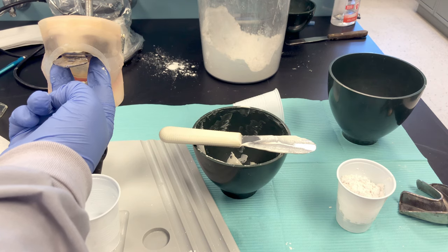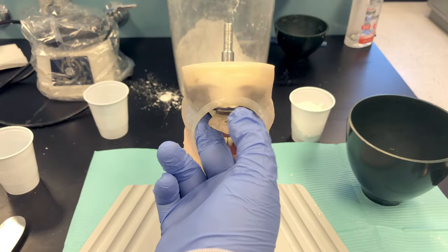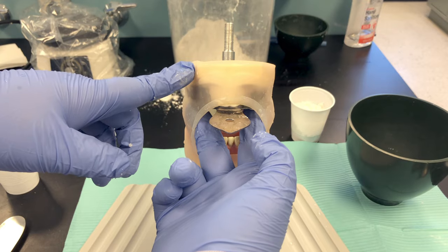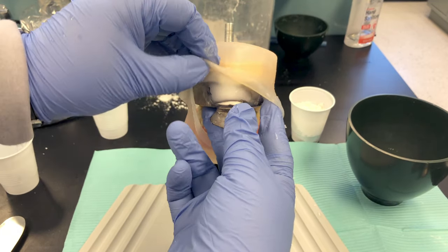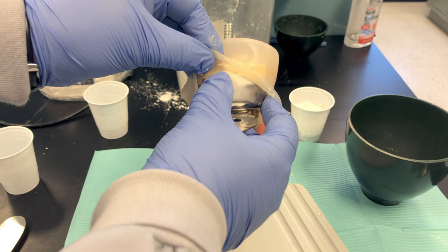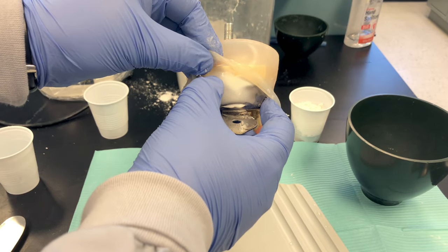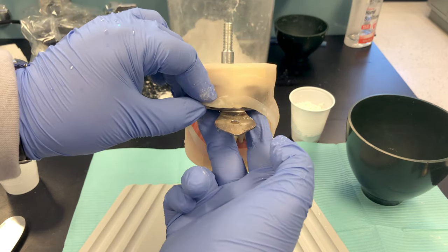Come back after about a minute to remove the impression. Determine the material is set by checking the excess material above the tray — if it feels firm and resilient and you can't dig a fingernail mark into it, it's ready to come out.